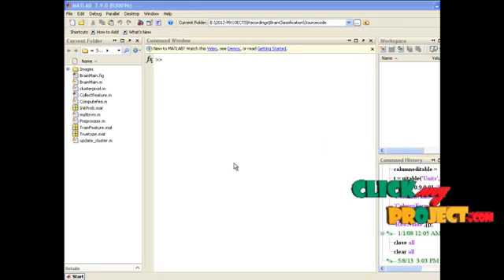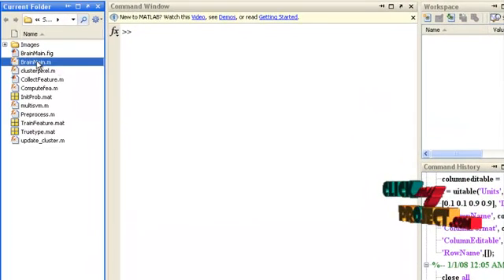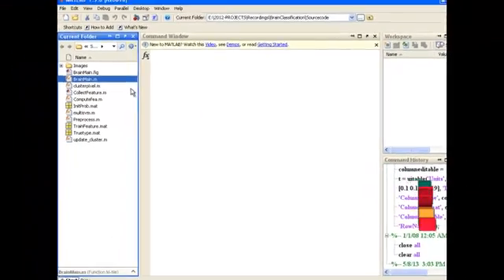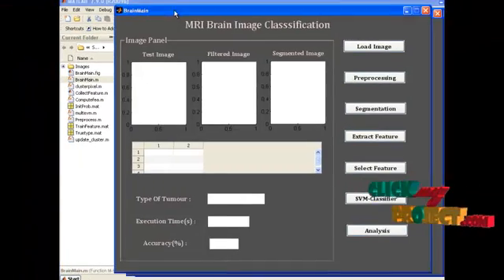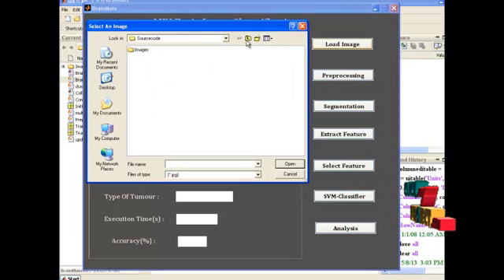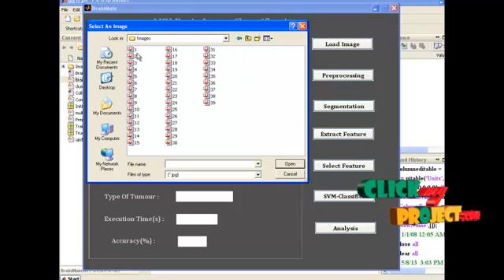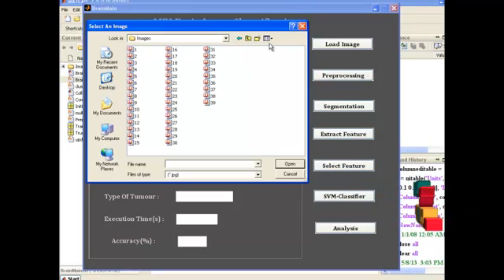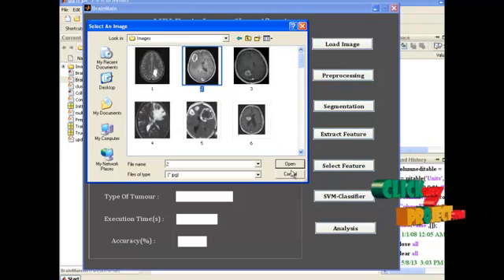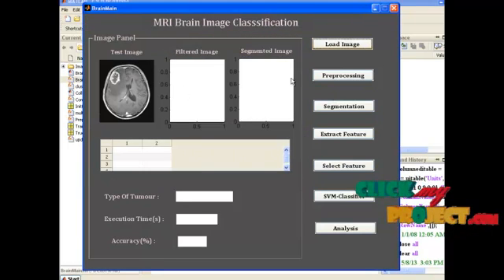Now let us see the demo of our proposed implementation. This is the main file, brain-main.m. Select this file, right-click, and choose the option run file. The GUI window is displayed. Now press the button load image. In the file browser window, under the images folder, select any one image. I am going to select the second one. It will be displayed in the corresponding axes control.